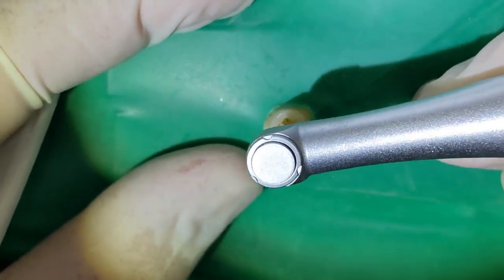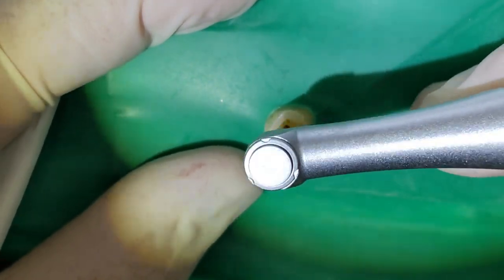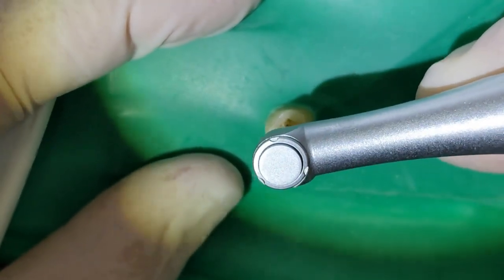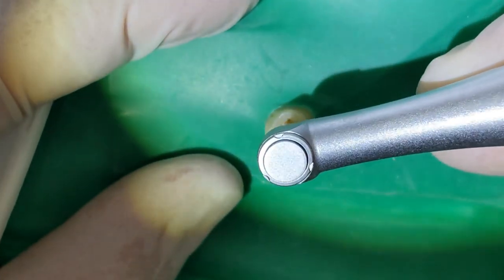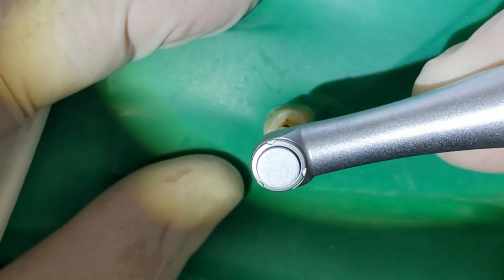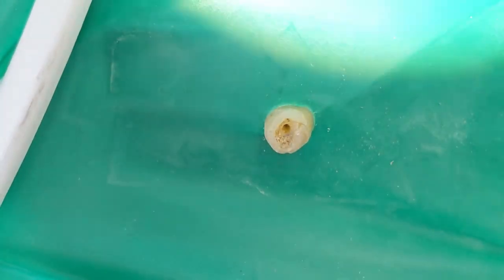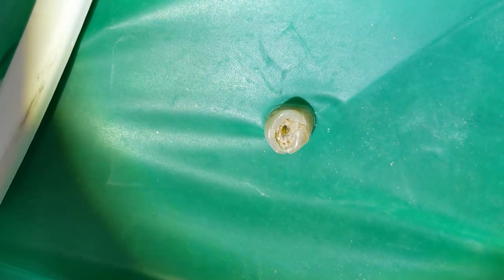Now normally, if I'm doing this for real on a person's tooth, I'll be using some irrigant in here, some sodium hypochlorite, basically some diluted bleach. It'll act as a lubricant. What I'll do with this tooth, since it's just an extracted tooth, is use some regular water, and we'll rinse that out. Okay, so now that we have that opened up, we can go to the next step.